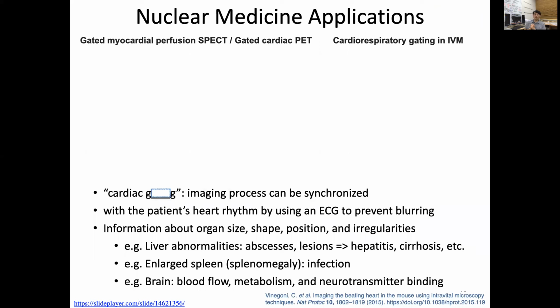So now I want to change a little bit of this imaging in a practical aspect. For applications, we want to measure heart dysfunction, especially if there's a myocardial infarction. I want to find out if there's any lesion, which is an underperfused area of the heart. The problem is that our heart beats all the time, and imaging this beating heart is very challenging. So we need to devise smart ways of knowing the heart beating.